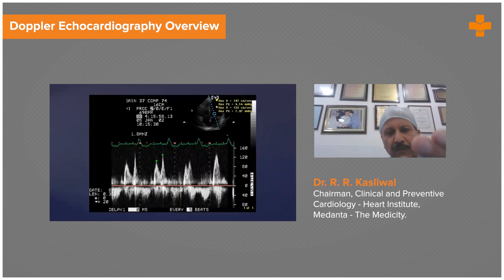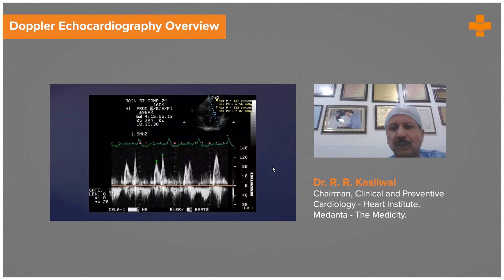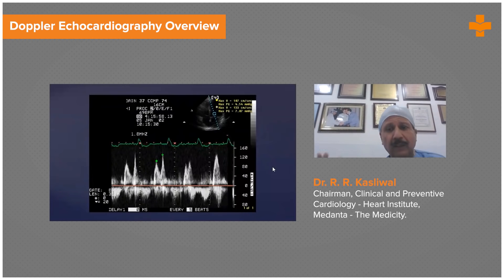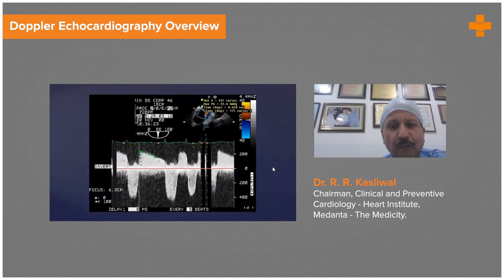Look at this. We have put a sample volume on the mitral leaflets. You can see the blood flow from the LA to the LV — the E-wave and the A-wave. This is one way by which you can actually find out whether the patient has any diastolic abnormalities. All the while we were concentrating on systolic abnormalities, and now we can even talk very correctly about patients who have stiff ventricles or abnormality of relaxation.